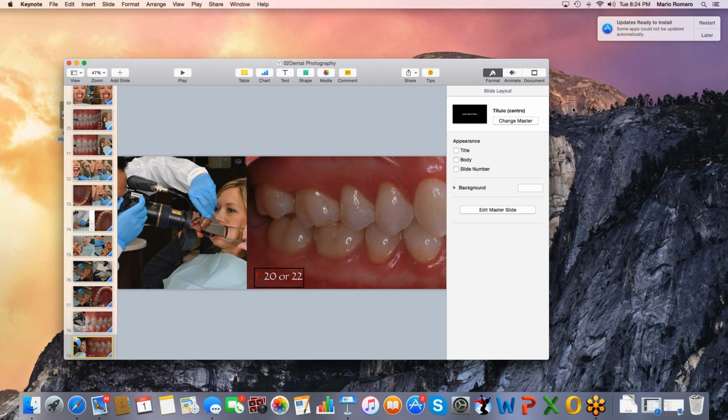But they sell the same technology they have for these photography mirrors. And the whole idea is that you don't get this double image on the mirror. So that has probably to do with the quality.